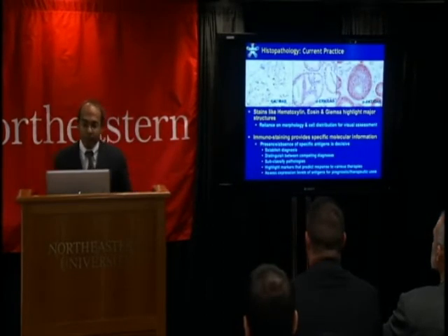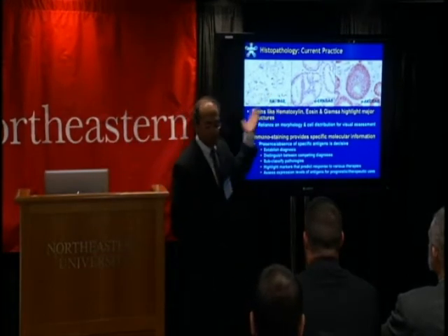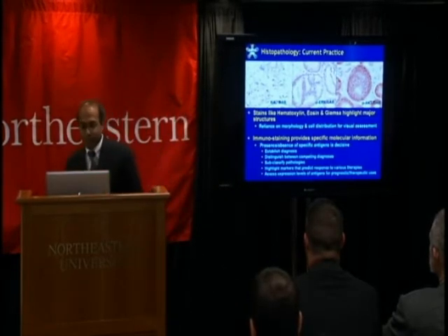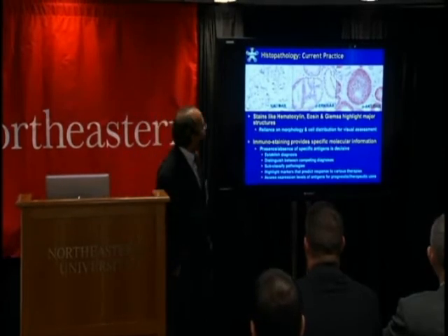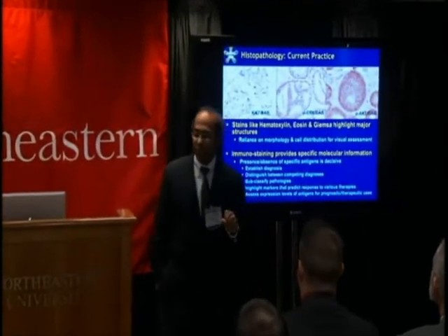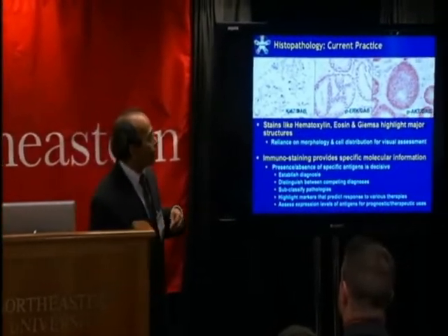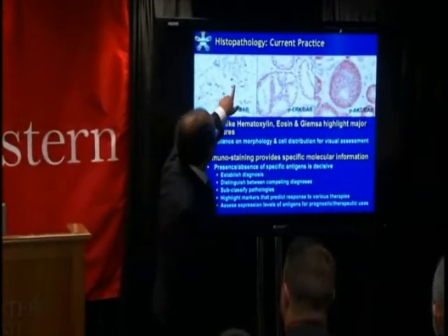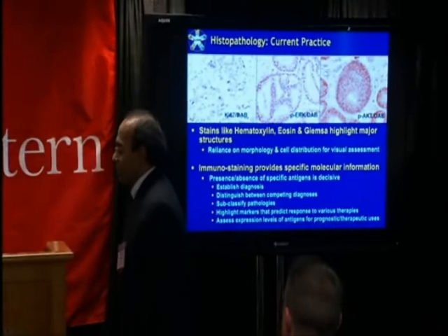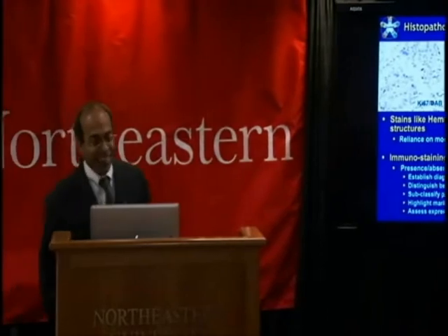So currently what happens is that the histopathologist is looking at these essentially RGB images through the microscope using his eye or her eye, and basically they're looking at cell morphology. What's the shape of the cell? Is it different from what it should be? And occasionally they're able to use molecular information. So they use chemical stains that result in colors. So for example, these differently colored cells here are essentially stained for a molecule known as Ki-67. This was a molecule discovered in the city of Kiev in dish number 67, so that's where it comes from.